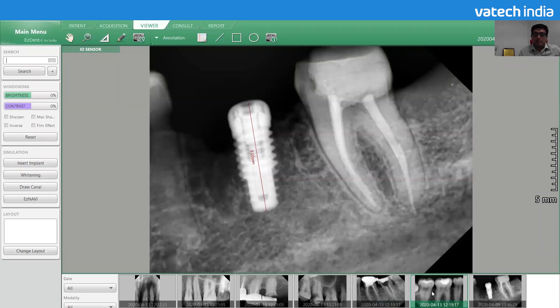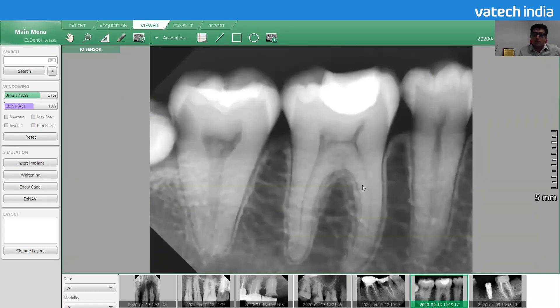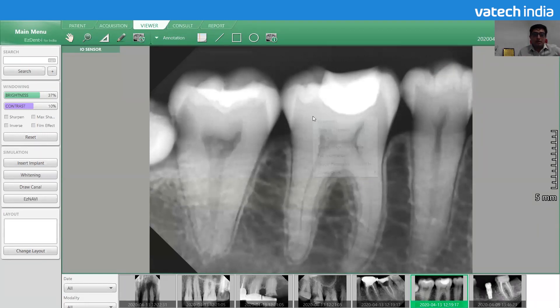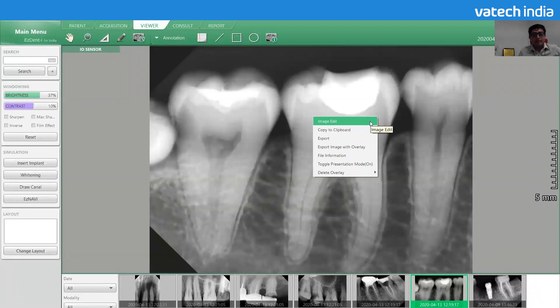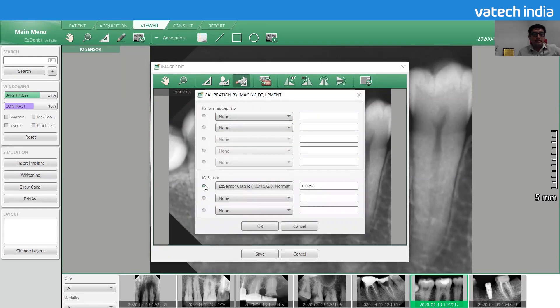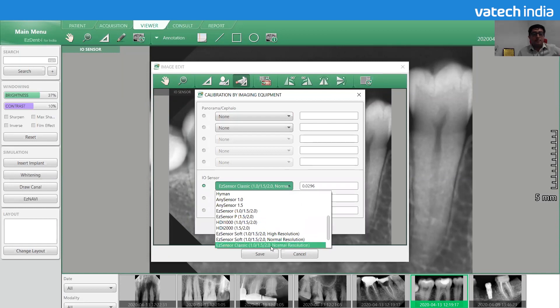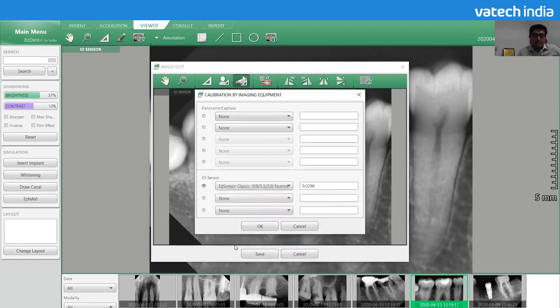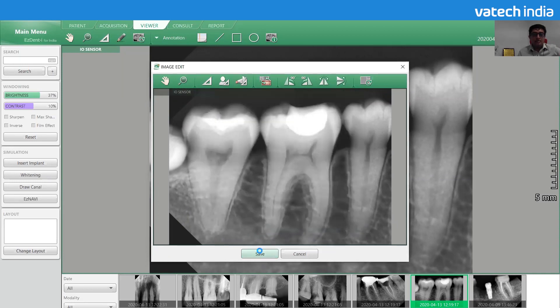The other way is for images where there is no known object. Because we are using VATEC software and VATEC hardware, the sensor dimensions — the length and width — are always the same. So there is an option to calibrate by model. Right-click, go to image edit, and select calibration by imaging. Select the intra-oral sensor image, choose the sensor type — Easy Sensor Classic — click OK, and save.